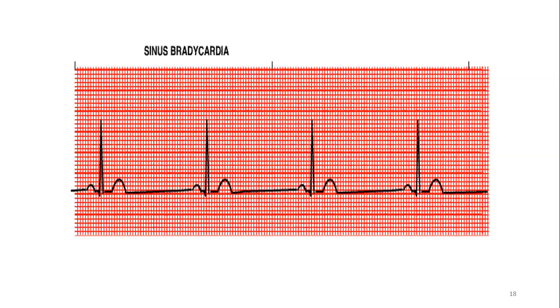So there are many ways that you can use in calculating the heart rate in an ECG. Let's use 2 methods in this ECG now. We can use the 6-second rule, or we can use the one where we divide 1,500 by the number of small boxes.